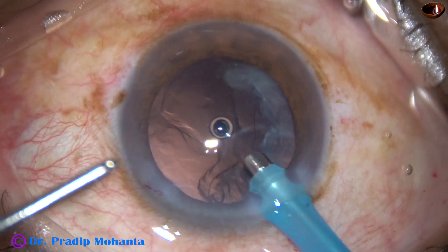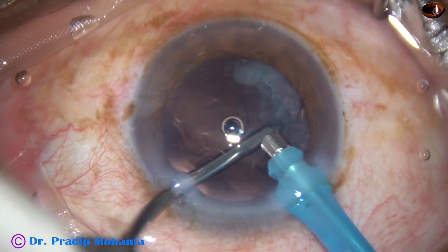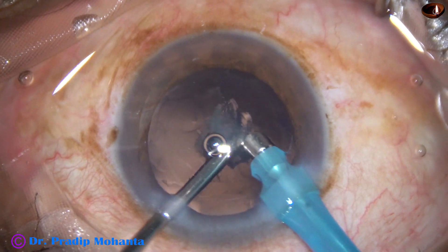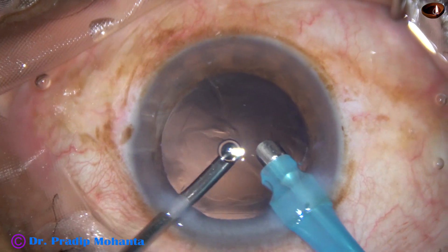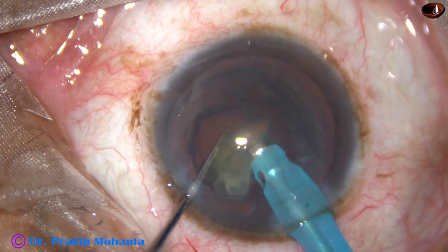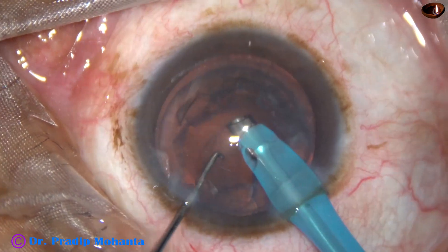Now introduce the handpiece with the irrigation and aspiration by the single side port — the same side port you have used to chop the nucleus into fragments with the chopper. The advantage of this technique is you don't have to make another side port.